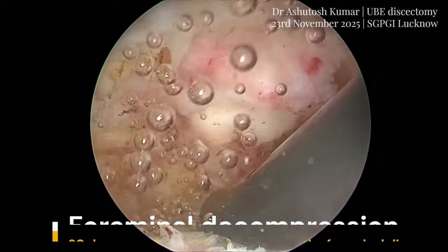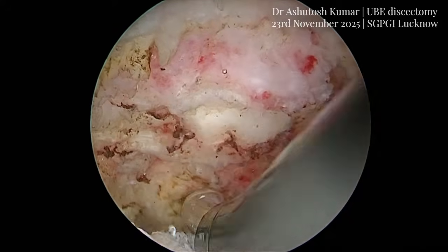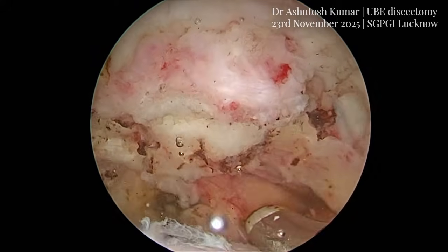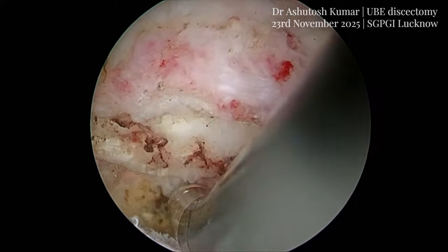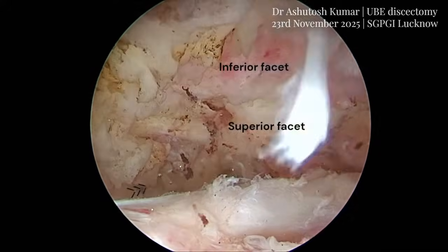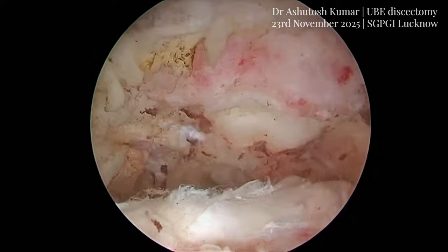This clearly demonstrates the feasibility and versatility of the sublaminar technique in addressing even extreme lateral disc pathology using unilateral biportal endoscopy. Here, we are working on the contralateral intervertebral foramina under the superior facet, thus decompressing the contralateral exiting nerve root.